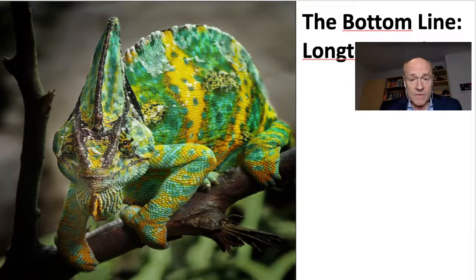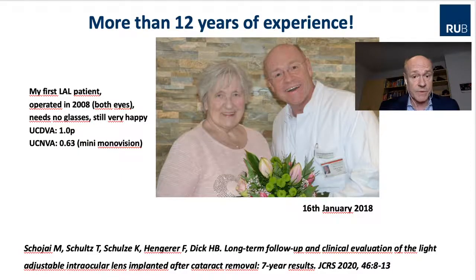But down the road, we have seen so many new technologies coming in and going out. Long-term safety, where we now have 12 years of experience. This is my first patient, operated in 2008. Still extremely happy with uncorrected distance visual acuity of 20/20 and 0.63 at near.